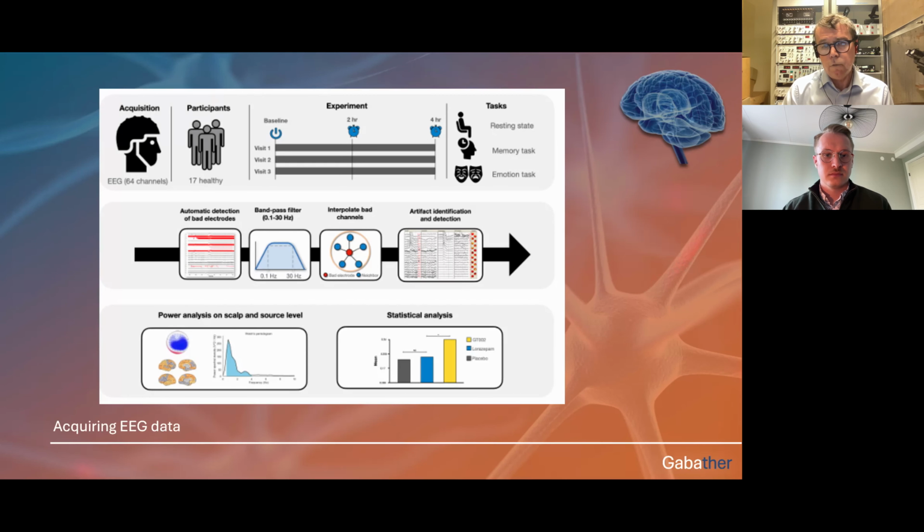In the case of EEG, for example, EEG is very, very sensitive. So you can think you have the person inside an fMRI scanner tube, like we saw in the previous one. At the same time, they have a cap on, and they actually have to keep the head in the same position. So they're reasonably, not tied down, but they shouldn't move too much. They shouldn't open and close their eyes too much, because all these things get directly into your acquisition system. If you open and close your eyes, you get a signal on the EEG. If you move your head, you get an artifact in the fMRI.